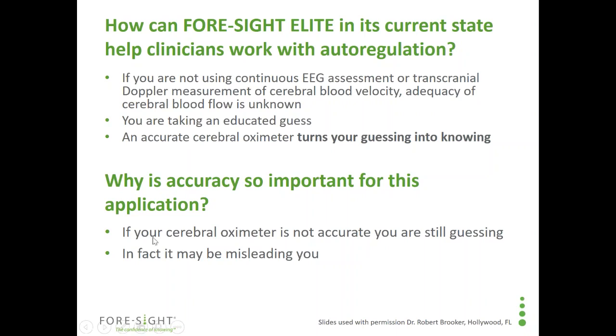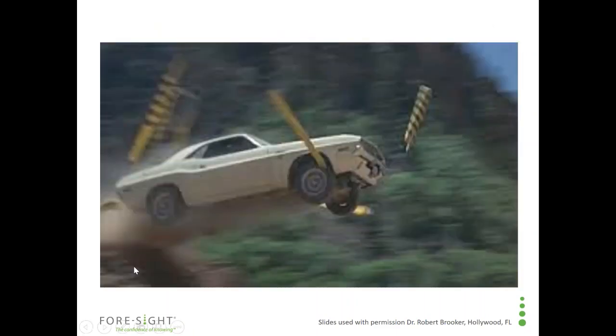But if you start using the CASMED device, you'll find that when you lower the pump flow rate, for example, to cross clamp or to take the clamp on or off, you'll see the oximeter dropping at a time when you would expect it to drop. So it really has provided us with a valuable tool to help manage our patients.